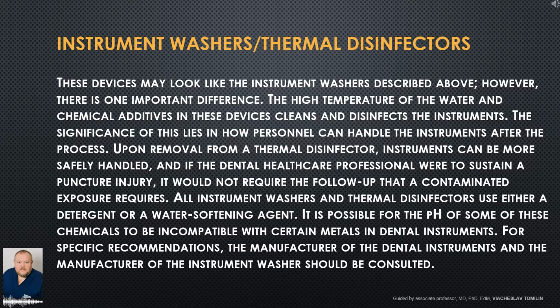Instrument washers/thermal disinfectors. These devices may look like the instrument washers described above. However, there is one important difference. The high temperature of the water and chemical additives in these devices cleans and disinfects the instruments.